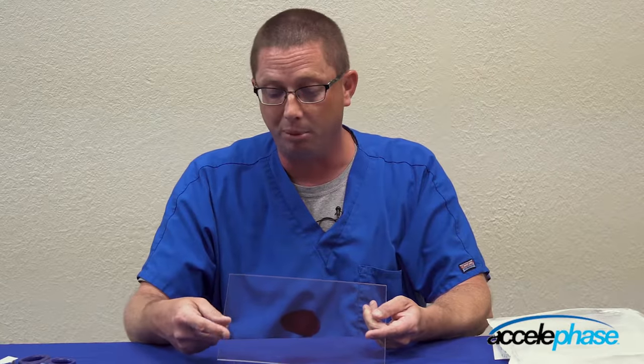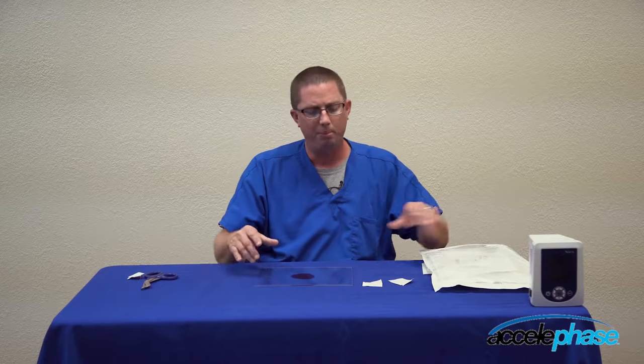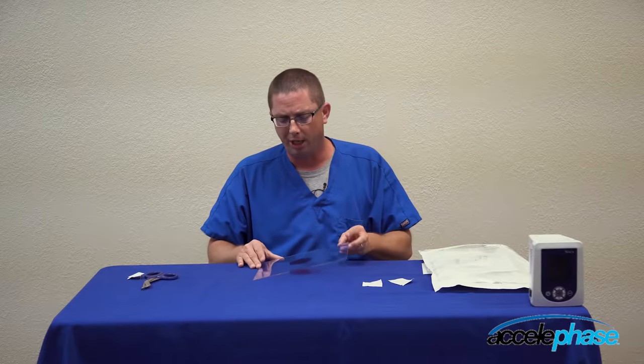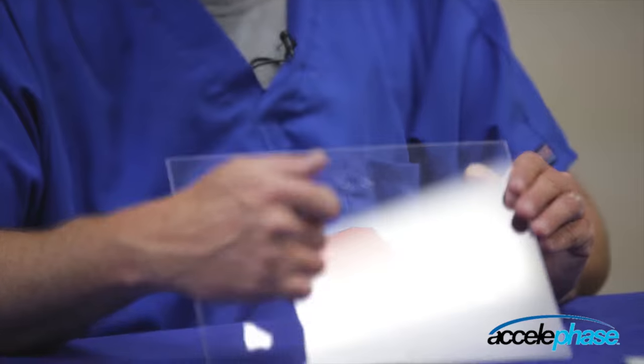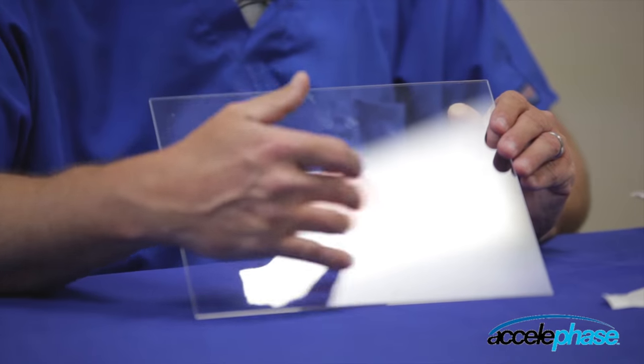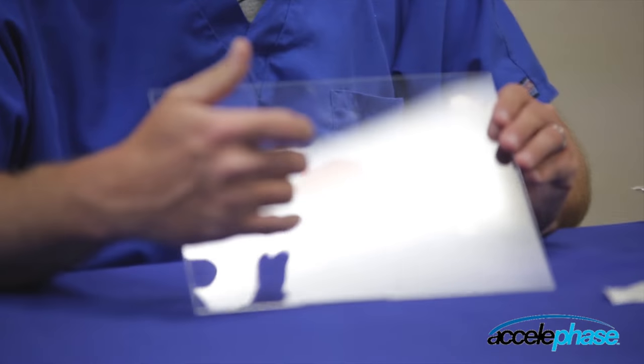The skin prep does two functions: it allows for the drape to adhere better, and also protects the skin from any shearing that might incur or irritation from the drape being applied. One of the basic principles of negative pressure wound therapy is you never want foam touching good skin around the peri-wound area.